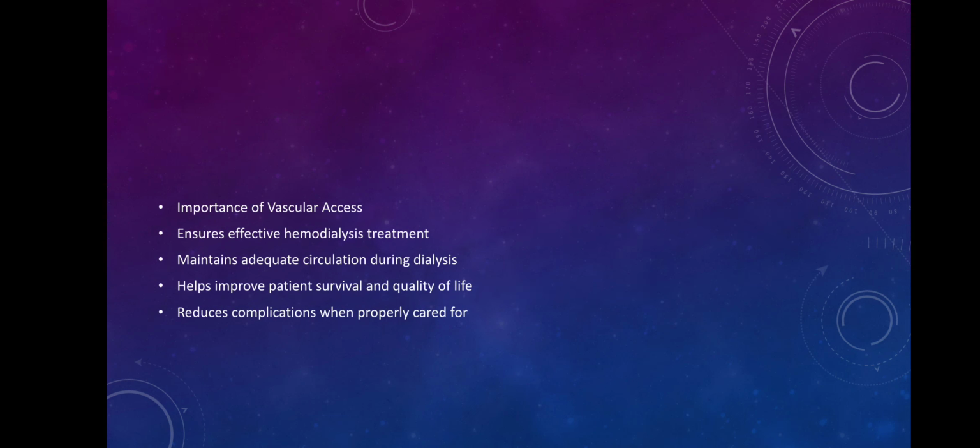Then the importance of vascular access: it ensures an effective hemodialysis treatment. It maintains adequate circulation during the dialysis and helps to improve patient survival and quality of life. It reduces complications when properly cared for.